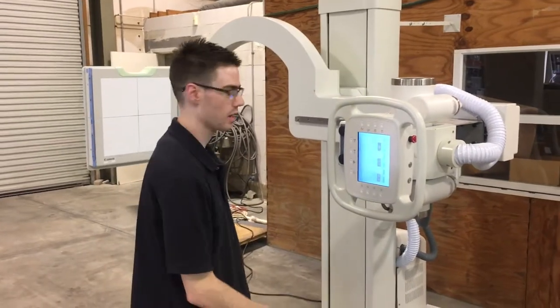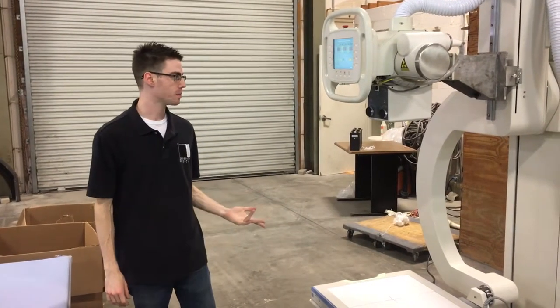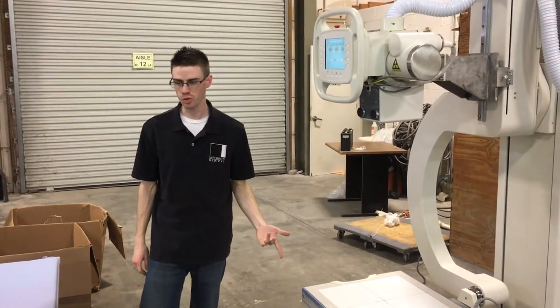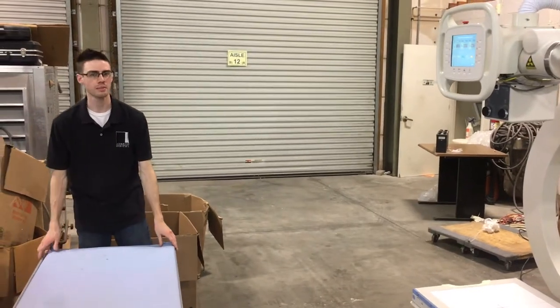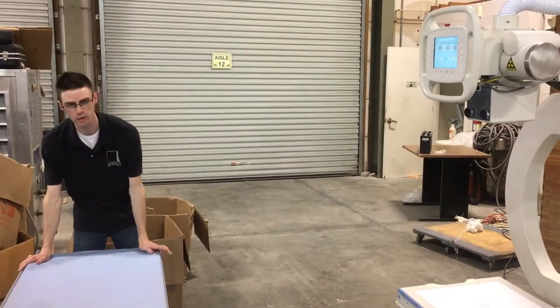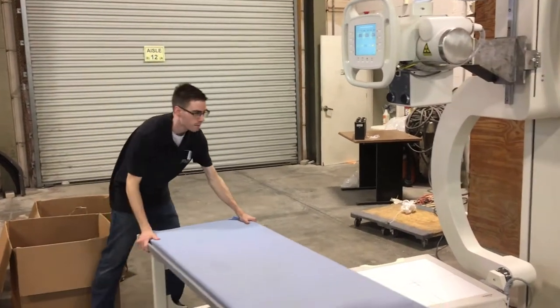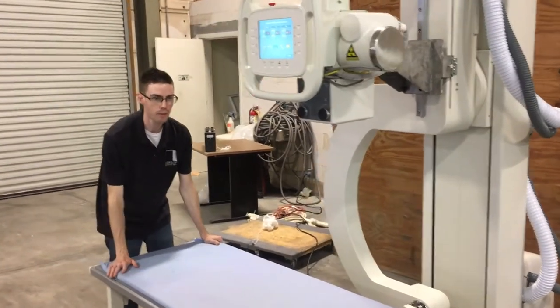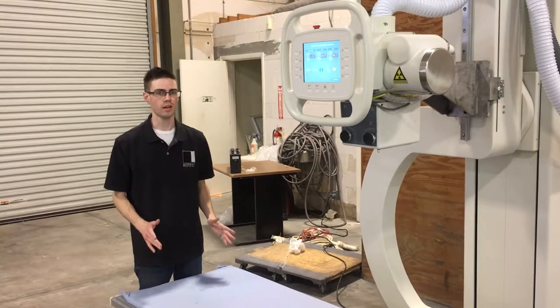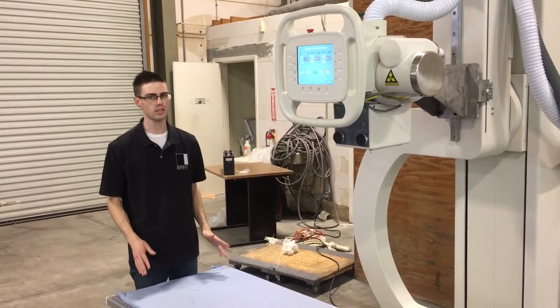Now we are going to put it into the vertical position. This is the U-Arm in the vertical position. This position is very useful because if you have a patient who's hurting, they have broken bones, and you can't move them, you can move the exam table under the x-ray tube and do an exposure of any part of their body while they're laying on the table. The whole point of this unit is to be able to make an exposure of any body part without having to move the patient.